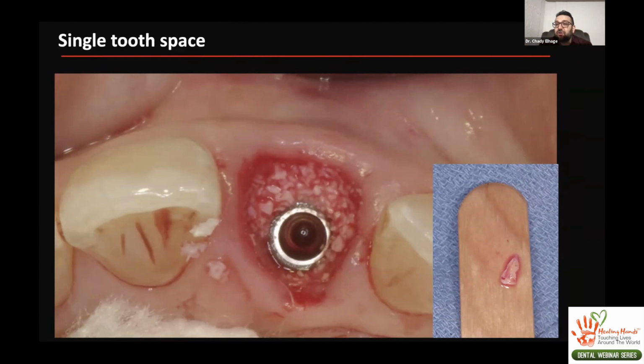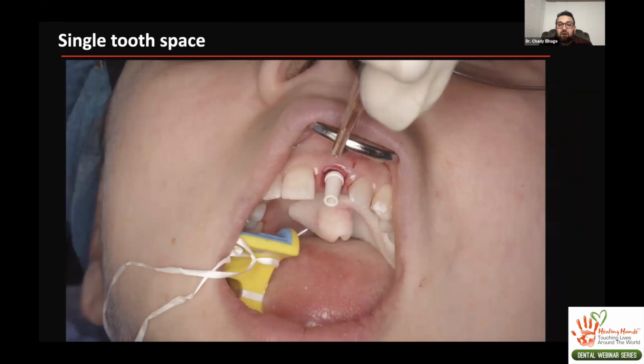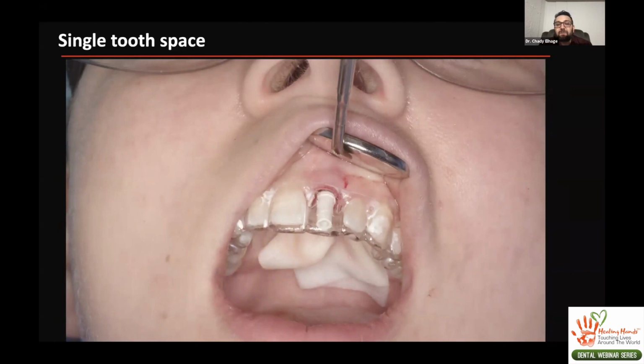So this is our temporary cylinder that the provisional is going to be bonded onto. I always kind of joke at this part, they make these things so big. So what I did is we have a retainer of what things look like before. So that's used to fit in place. We cut down that temporary cylinder.